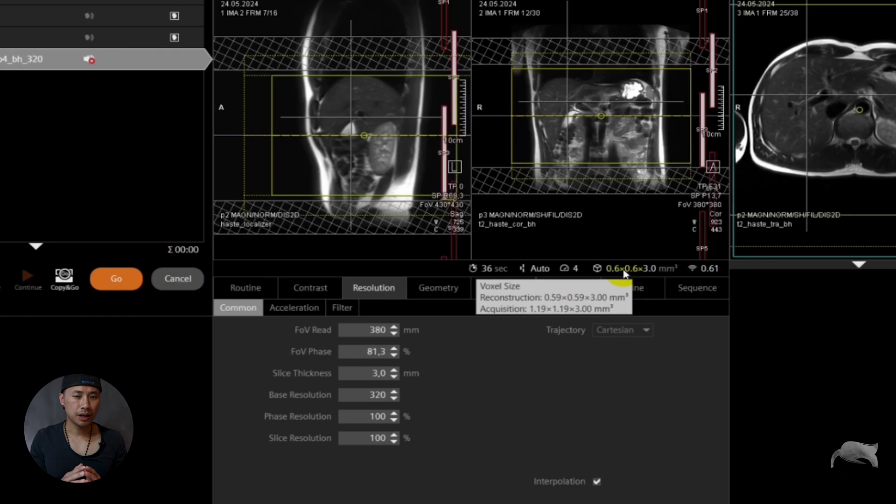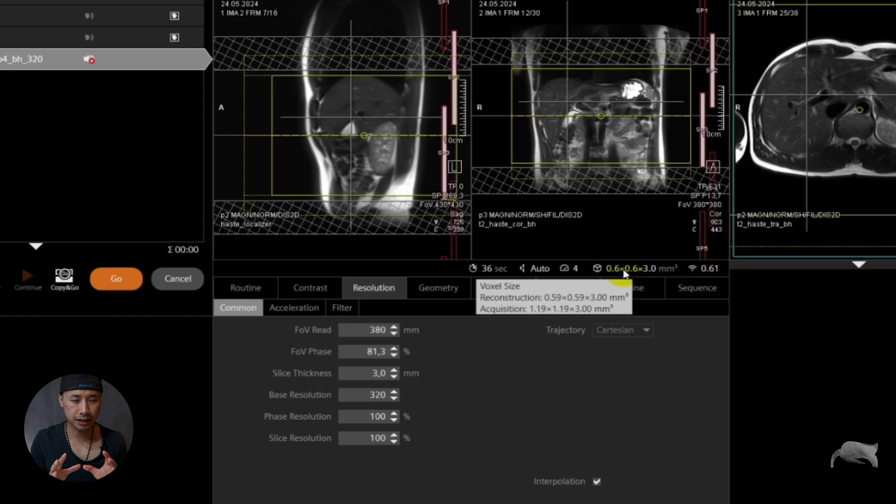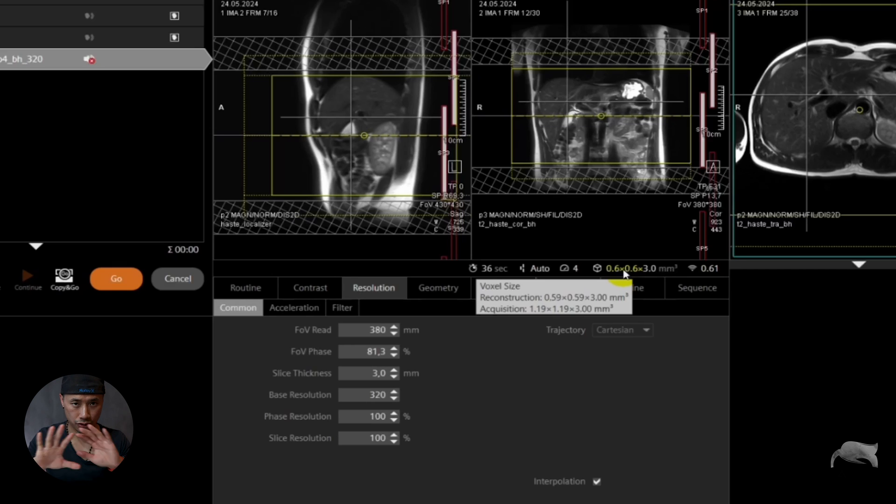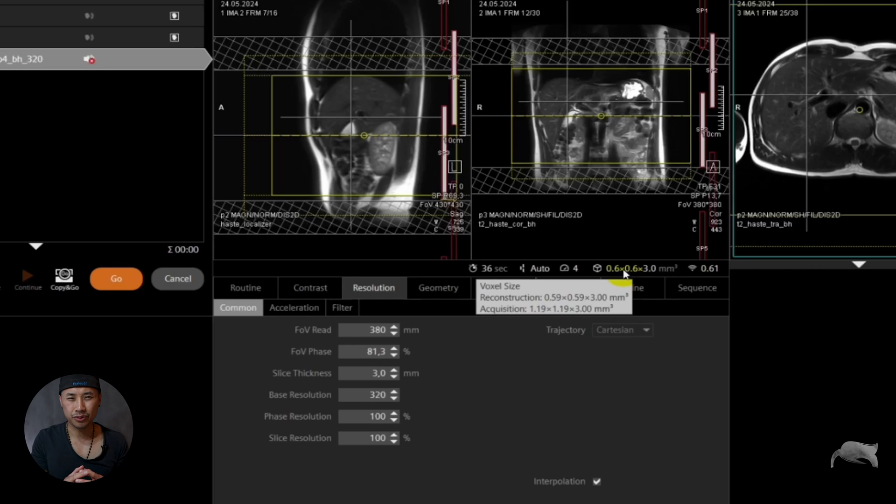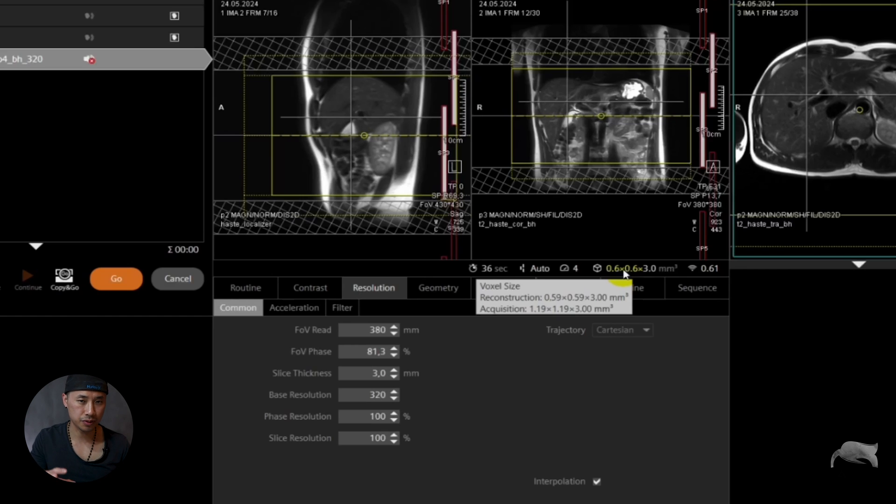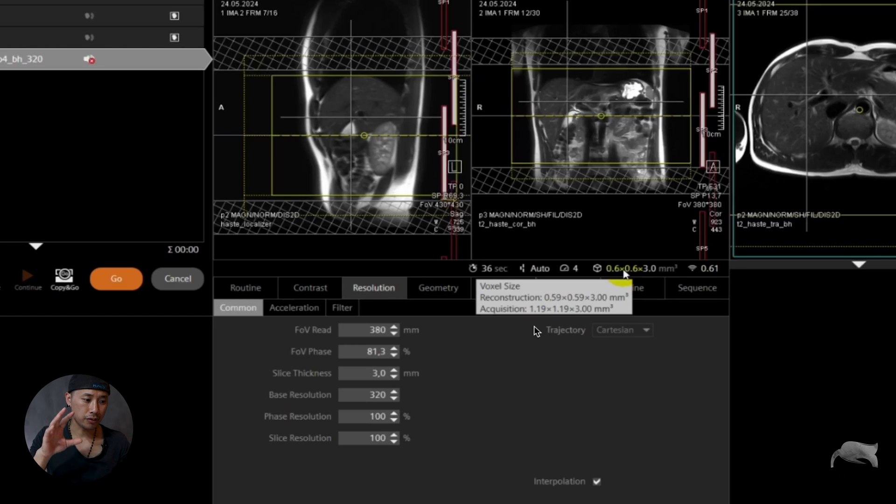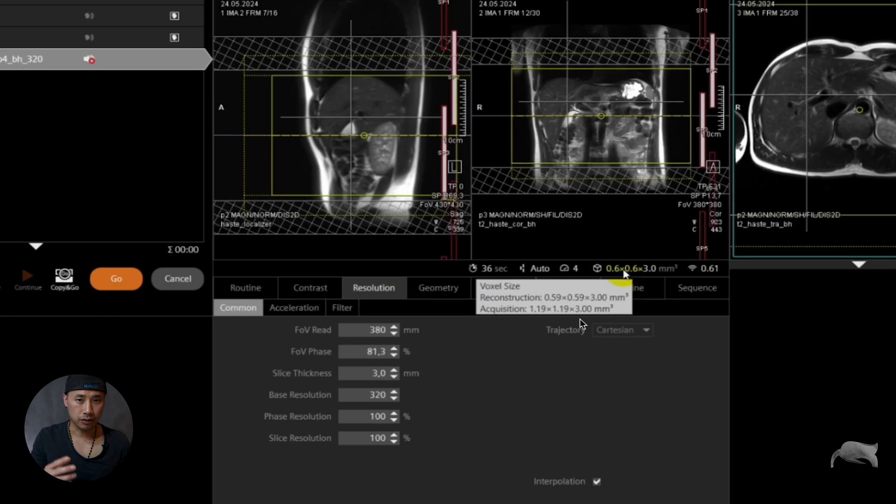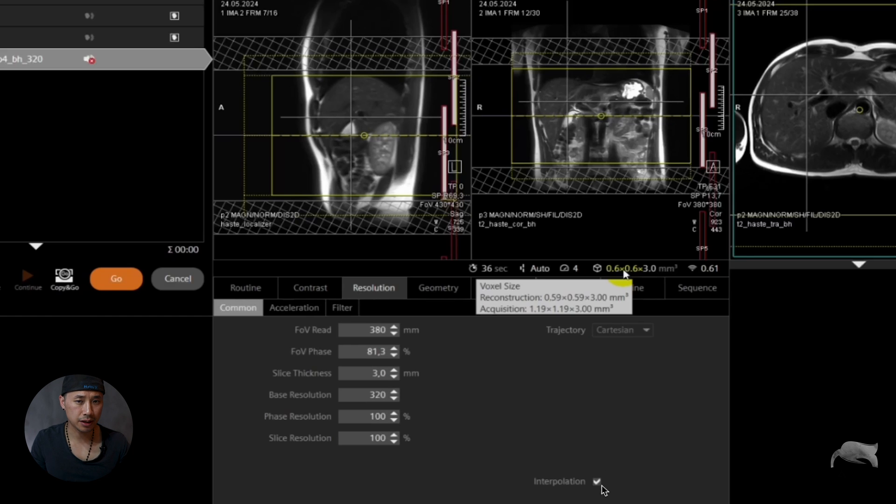If you choose the phase resolution 100% as well, that means now that you are doing everything as true, no interpolation or reduction in the percentage when it comes to phase and slice. That means that you acquire now 1.19, 1.19, and then 3 millimeter.